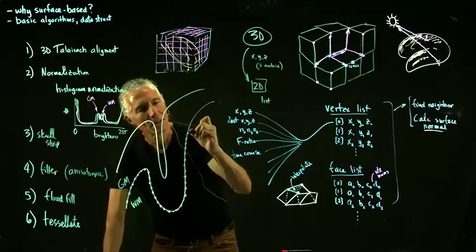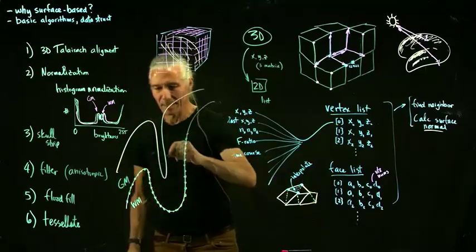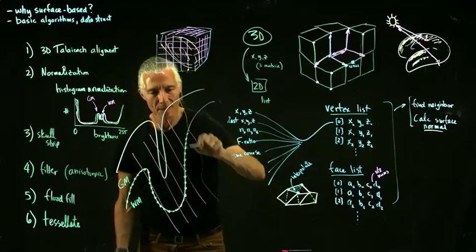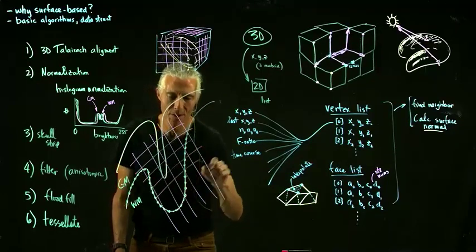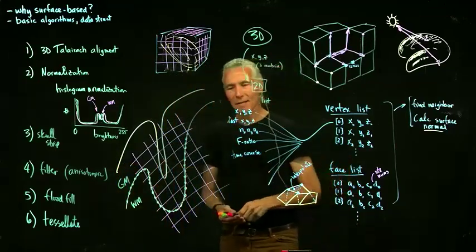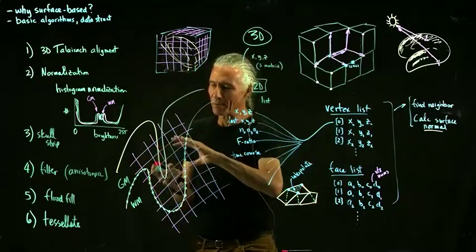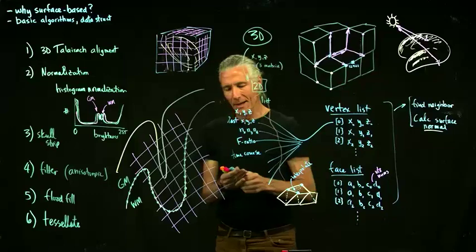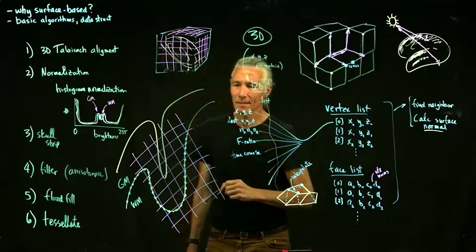So there's all our vertices, but we did some functional MRI, and so here's some functional MRI voxels. They're bigger. They're maybe something like about this big. And we lined them up. We lined up the functional MRI with the structural scan. That's another whole nightmare, but how do you do that? You have to align up that functional data with the actual structural data. But say we've got it lined up, and then what we do is we can say, okay, what's the data at that vertex?